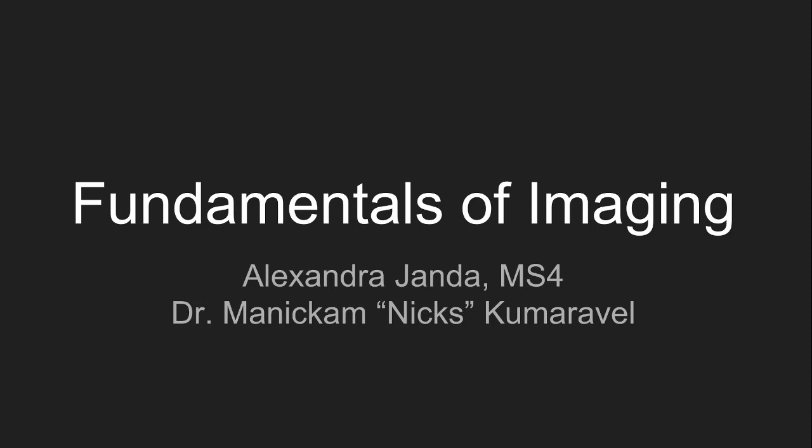You will see x-rays, CTs, ultrasounds, and MRIs for the rest of your career, whether it be in the classroom, on your step exams, on clinical rotations, or in your future practice. Today, my goal is to provide you with a basic understanding of how these imaging techniques work, so you can ace your exams, impress your attendings during rounds, and use imaging to its fullest potential once you all are the doctors in charge of ordering scans for your patients.